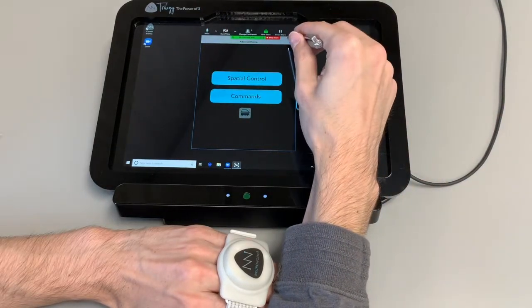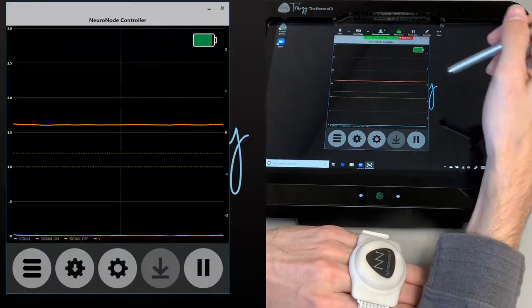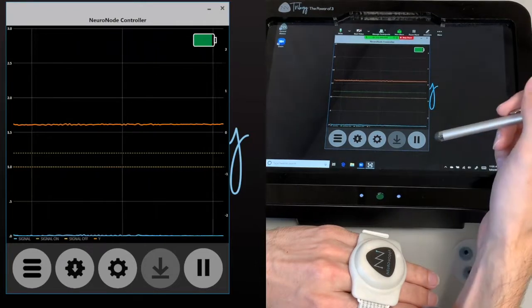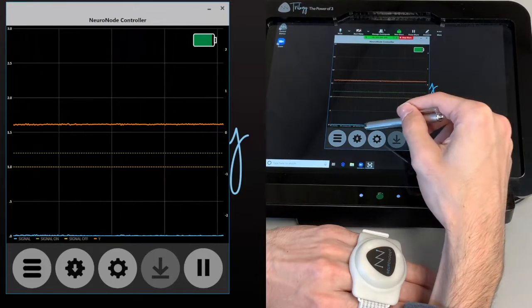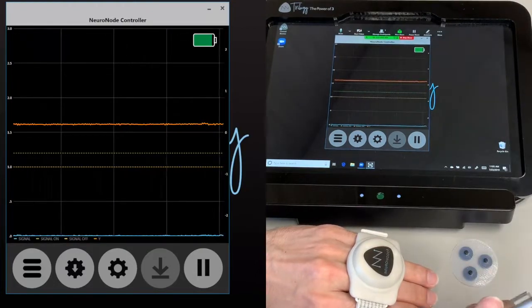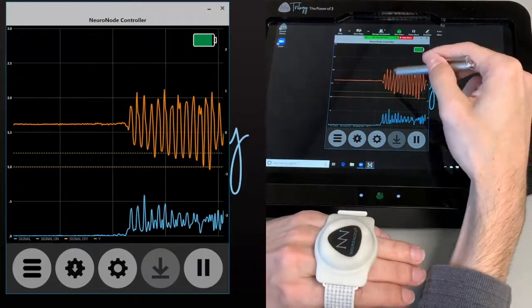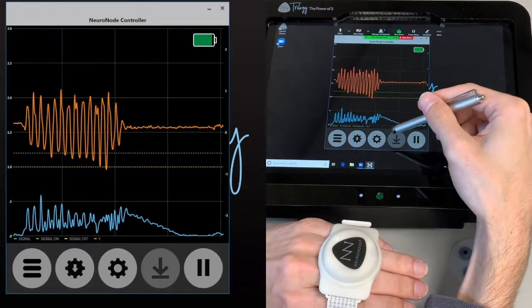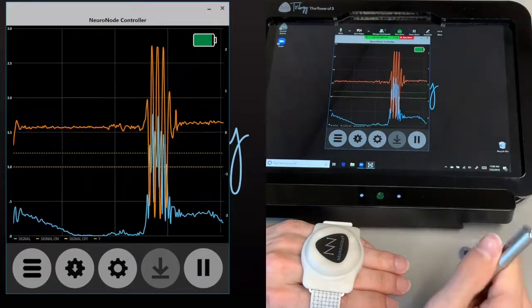So I'm going to press OK and then Done up here at the top, and go back to the graph. As you can see, we only have that orange line here — you can turn that display off as well so that you can have it at 100% but uncheck the box for this Y coordinate, which it shows down here. But this is just to show that now we're going to be kind of matching this movement to our signal down here. And the more I shake it, basically the louder or the more it's going to read.